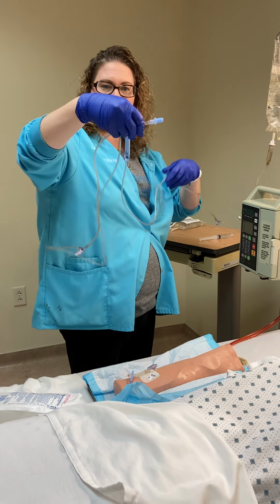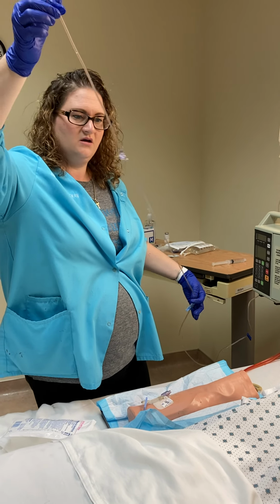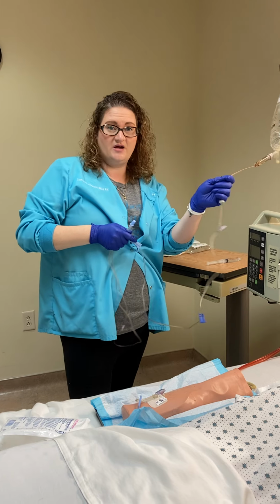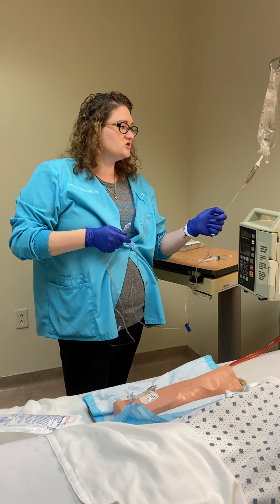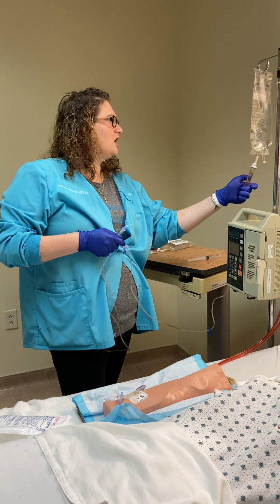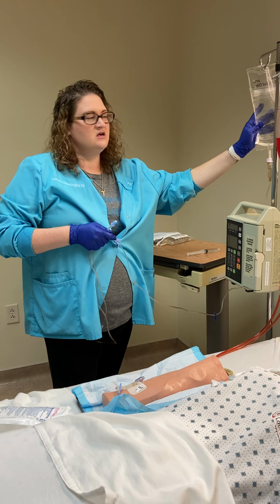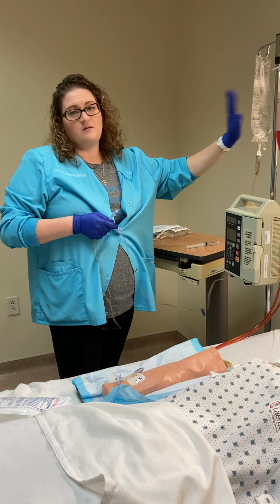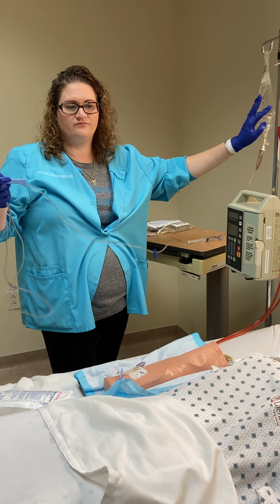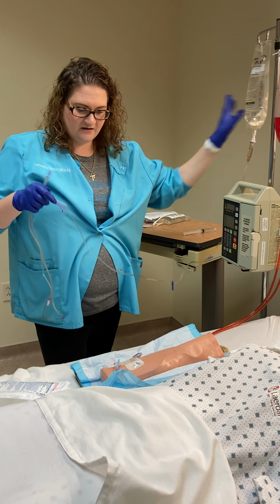All right, so we've got this fully primed. I have no bubbles in the tubing. It looks good. I'm going to label my tubing with the date, time, and initials so that everybody knows when I put the tubing up. I'm also going to label my bag with the date, time, initials. Depending on your facility, they might want your patient's ID sticker on there too. So just be mindful of that.